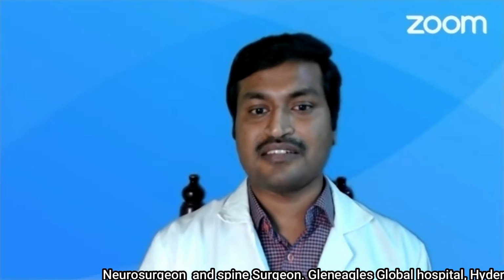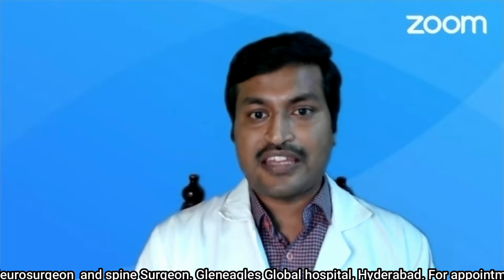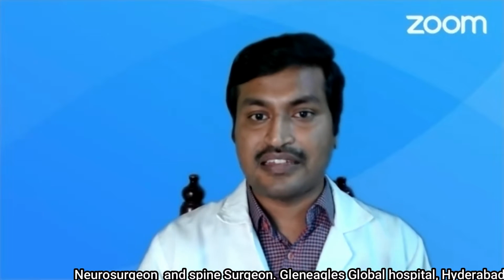Welcome back to our next session of training for emergency neurosurgical techniques. In our previous session, we discussed evacuation of lateral frontal and temporal contusions by the modified pterional technique. You can consider this a continuation of the previous session. Here we'll be discussing evacuation of frontal contusions by the bifrontal technique, which is more appropriate for frontal contusions located on the medial part of the frontal hemisphere.